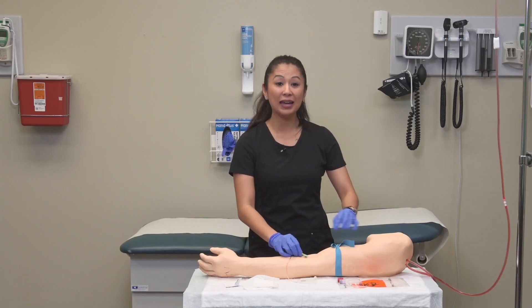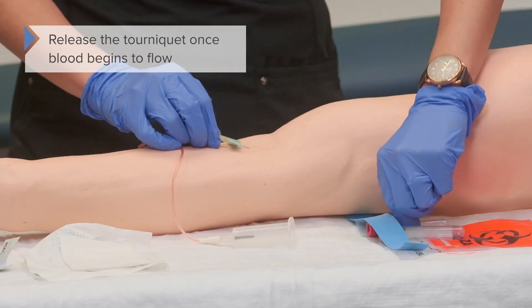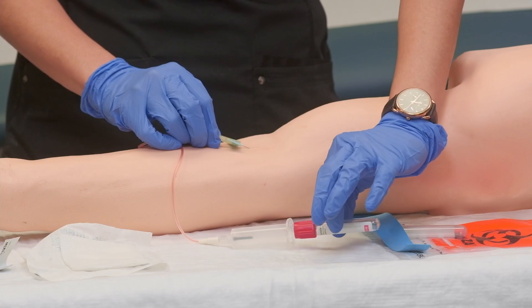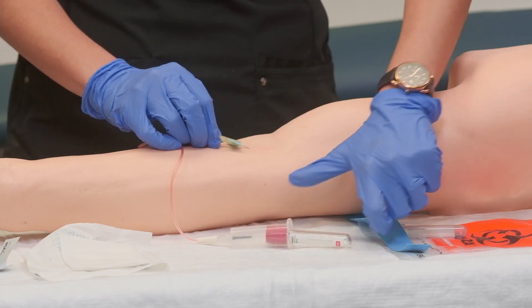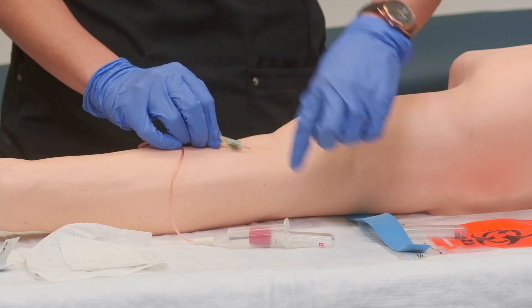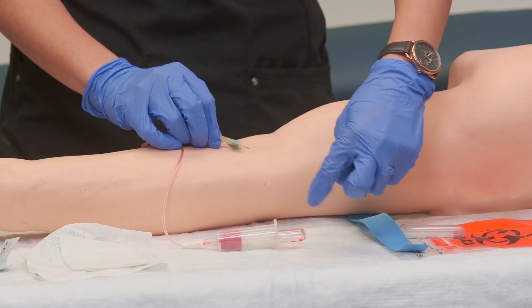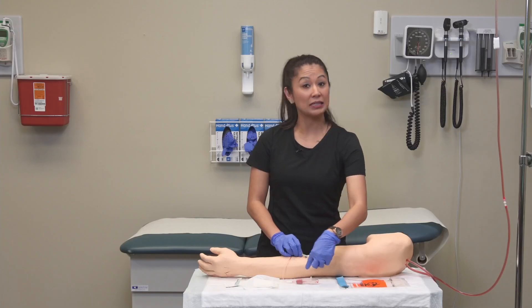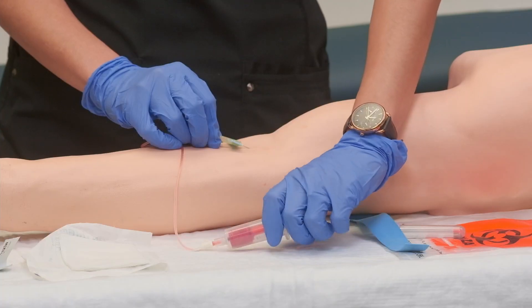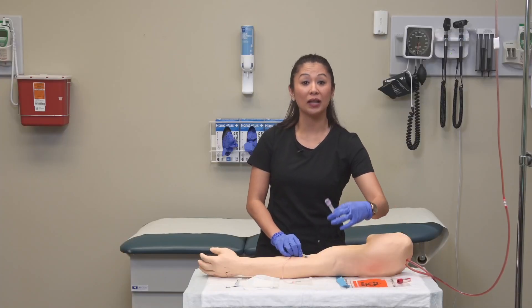Once the blood is free flowing, go ahead and release your tourniquet. Take the waste tube, keep it flat, stick it into the blood transfer device, and push the end. The gray cap has a puncture that releases the vacuum to help pull the sample — push it all the way to the top and it will fill. Once there's no more air in the line, remove the waste tube and replace it with your lab collection tubes.